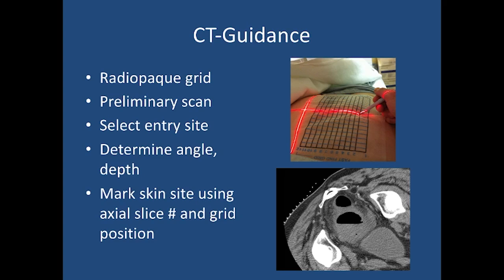With CT guidance, generally speaking, some sort of marker or grid is placed on the skin. A preliminary scan is performed and an entry site is selected along the grid or radiopaque marker placement, and the angle and depth of needle placement is determined and the skin is marked.